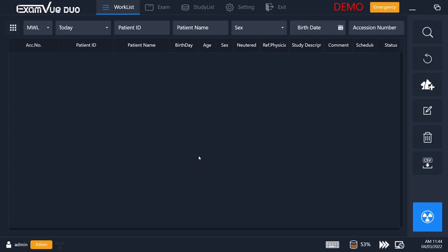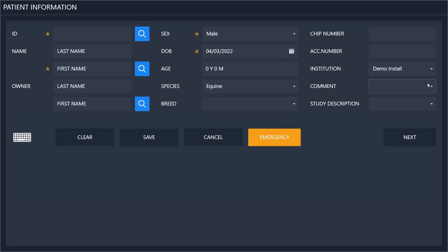When you log in, the first thing you'll see will be the worklist. Here, if you are connected to a practice management system, it will show you all of your patients and their scheduled X-rays already laid out for you to take. On the other hand, you can also register your patients at the acquisition station as they come in, simply by clicking on the new button on the right and then entering the patient information.